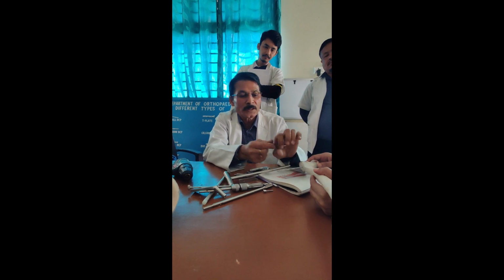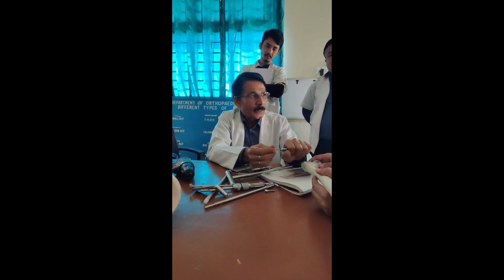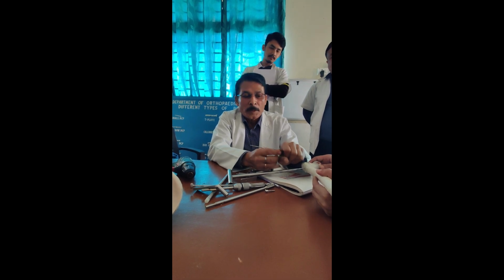You can put the guide wire inside, and put the guide wire inside again like this. So tap it, fix it. Then you put the screw inside. Finally it is supposed to be here. So now one point is there.